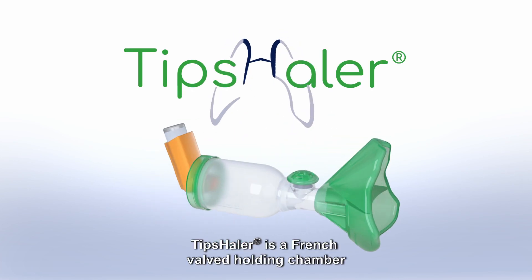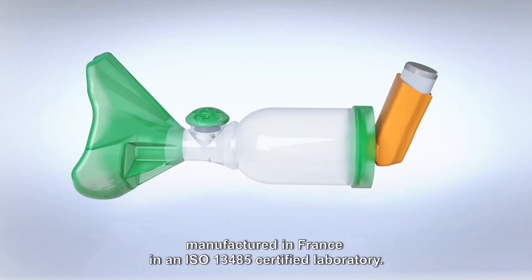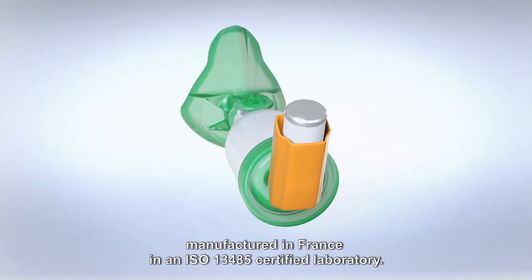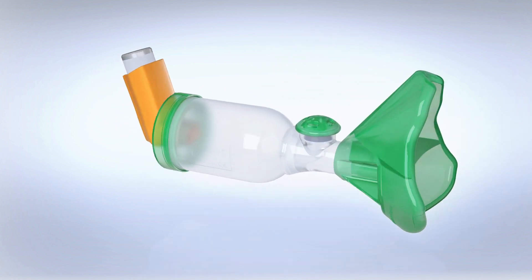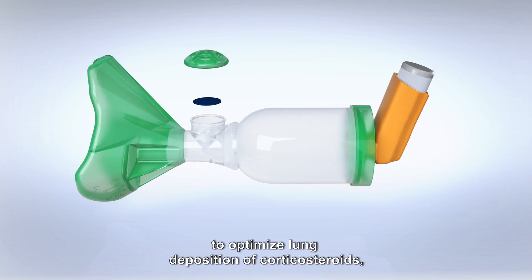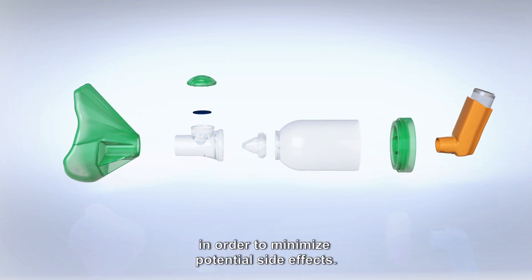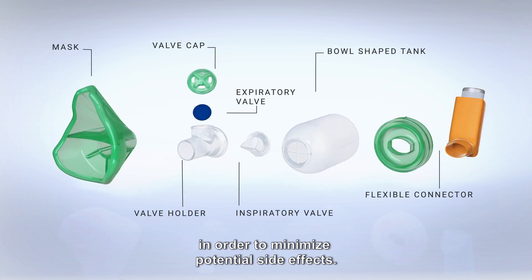TipsHaler is a French valved holding chamber manufactured in France in an ISO 13485 certified laboratory. TipsHaler was designed especially to optimize lung deposition of corticosteroids alone or in combination, in order to minimize potential side effects.